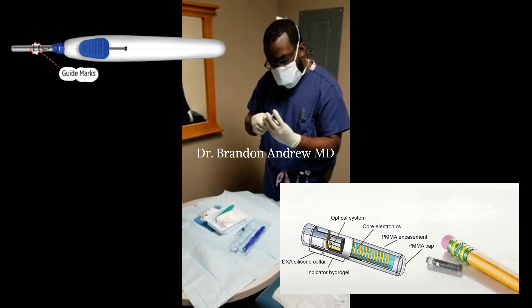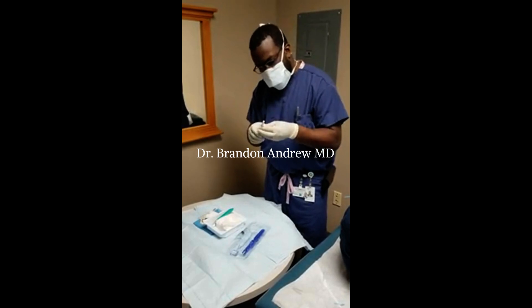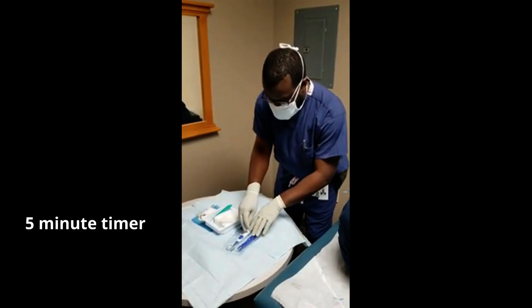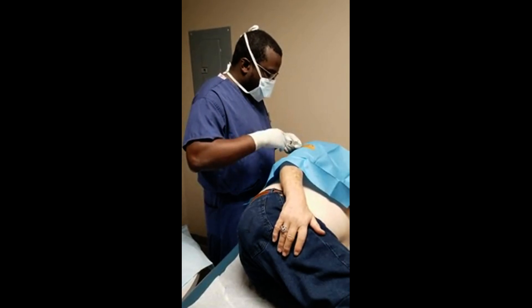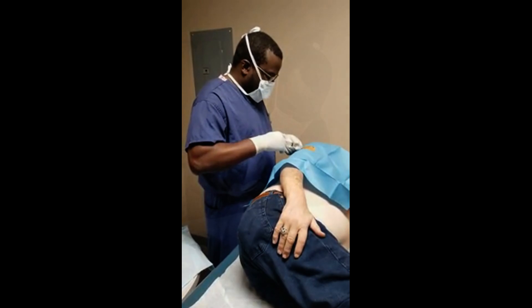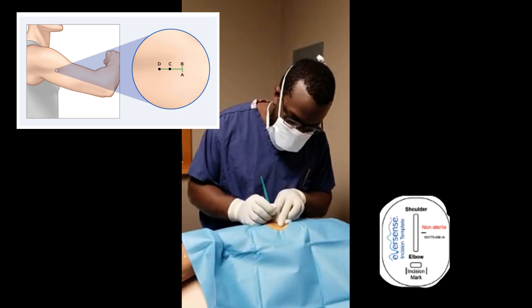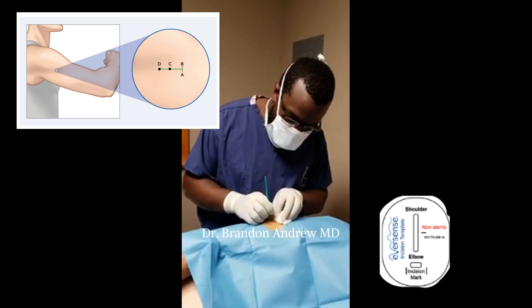The sensor has to soak for five minutes, and during that time you can prepare the patient, create the incision, create the pocket, and confirm hemostasis. All of those tasks take less than five minutes, so you won't be waiting long for the sensor to be ready. We give the patient some analgesia and give it a minute to take effect. When creating the incision at the marked site, it's very important to make a full-thickness incision. You should feel a physical pop as the blade goes all the way through the layers of the skin.